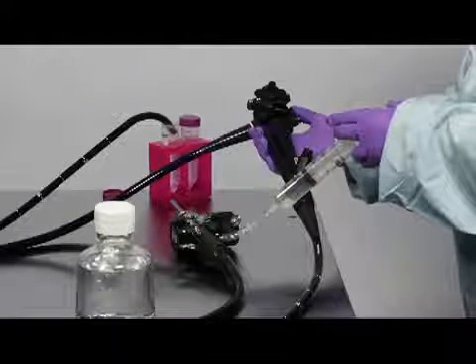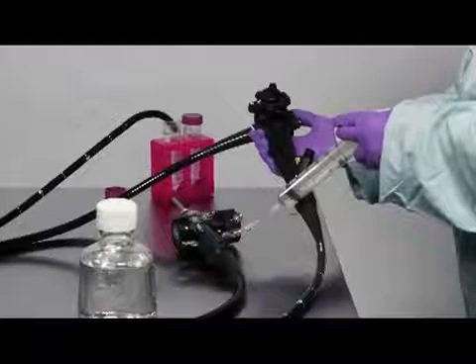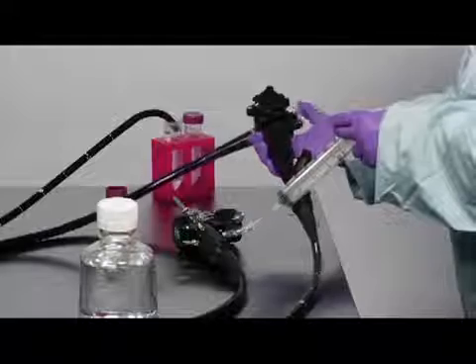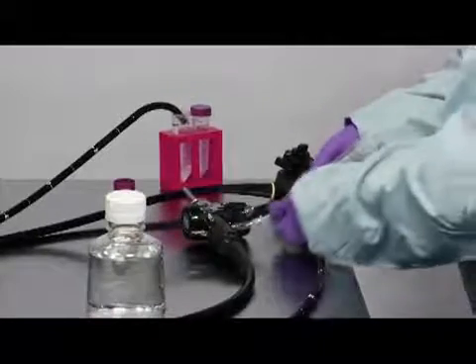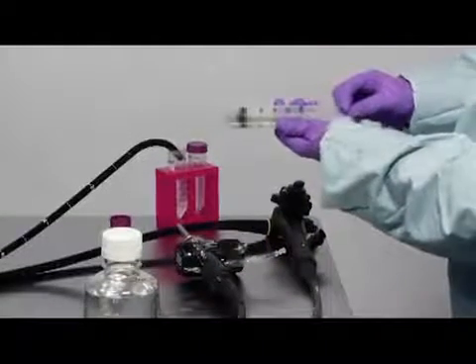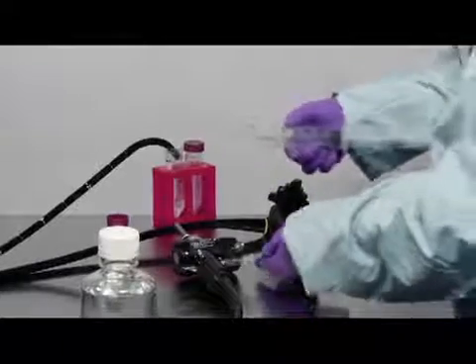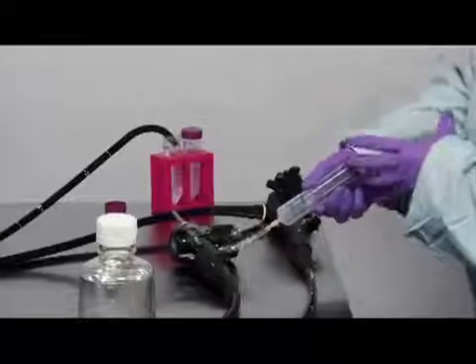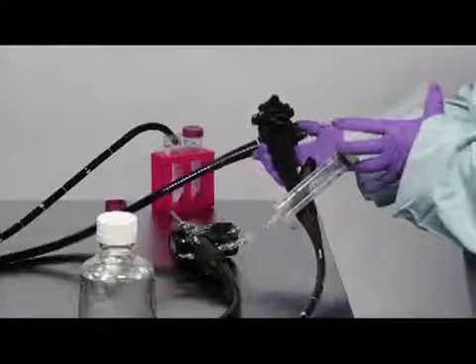So while you've actuated the valve, we're pushing the 40 mils of water through, and you may get some of that 40 mils coming out into your sample cup, but in order to make sure all 40 mils are pushed through, you need to remove the syringe and pull the syringe back and get 60 cc's of air in there, and then put it back on the connector and use that air to push the rest of your sample through the suction biopsy channel, and then you'll see that coming out into your sample collection cup.